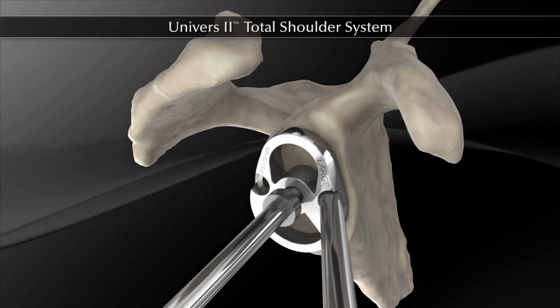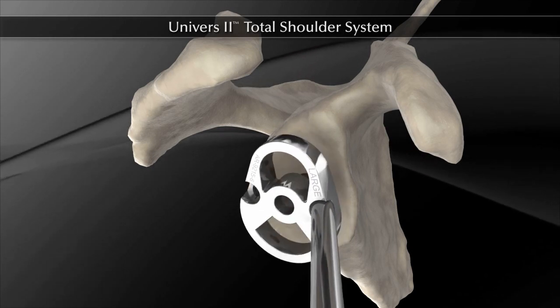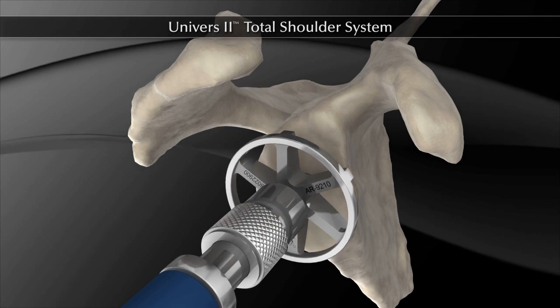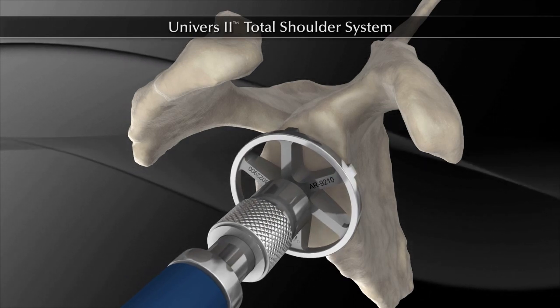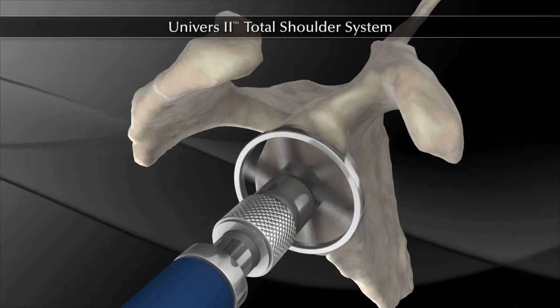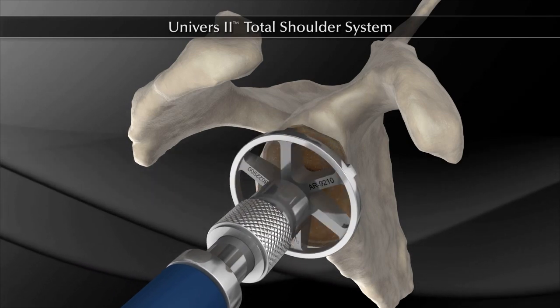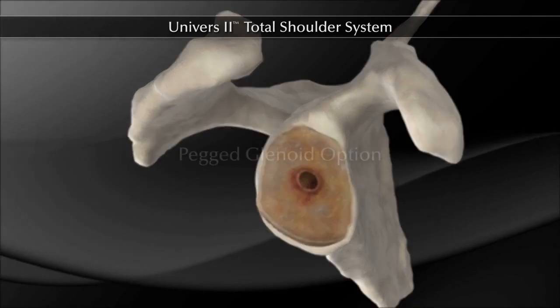Begin drilling and continue until the mechanical stop on the drill engages the guide. Remove the drill and guide. Next, the appropriate size glenoid reamer is assembled to the reamer shaft. The nipple end of the reamer is inserted into the central glenoid drill hole and reaming is initiated. If desired, it is acceptable to ream up from the small glenoid reamer to the reamer corresponding with the chosen glenoid implant size.